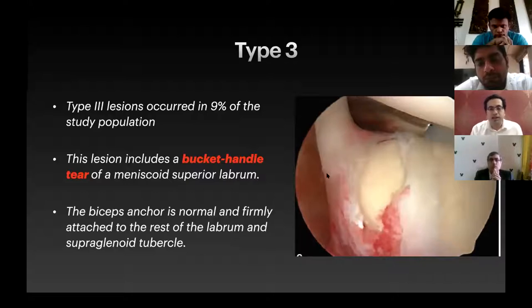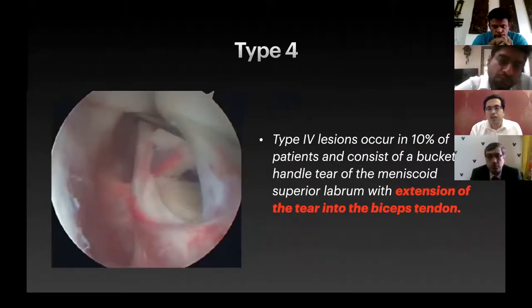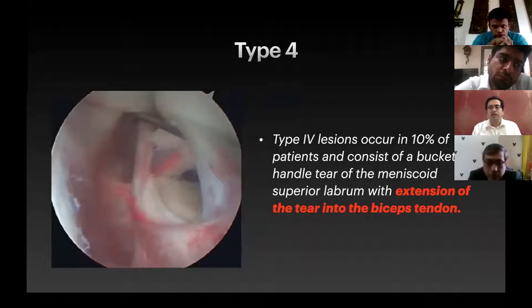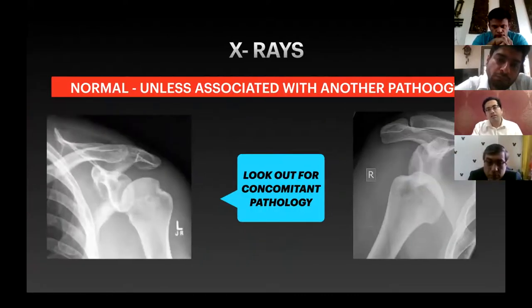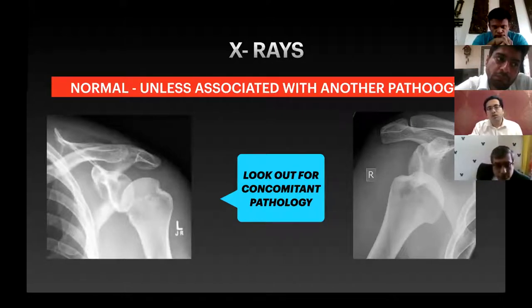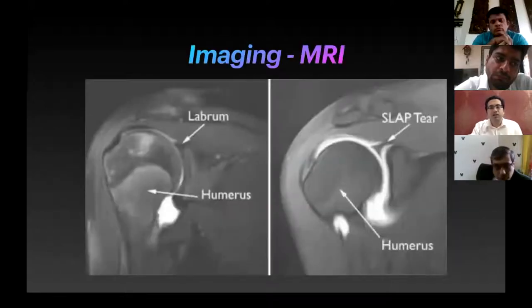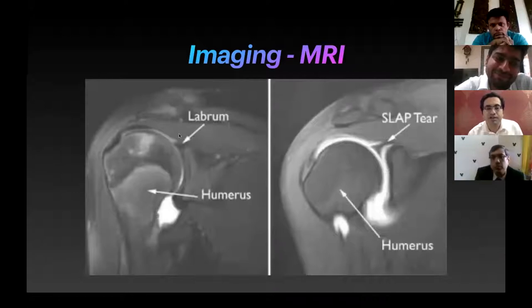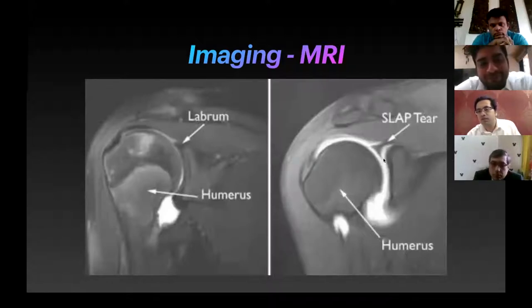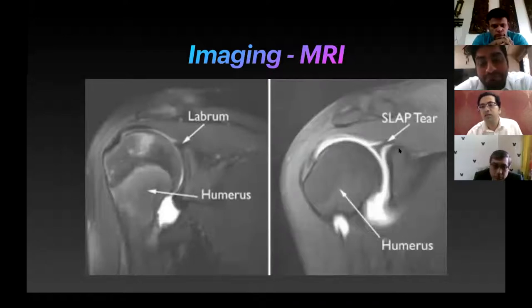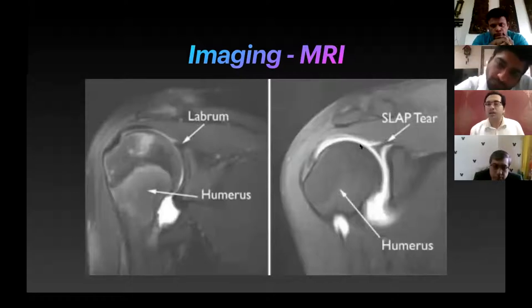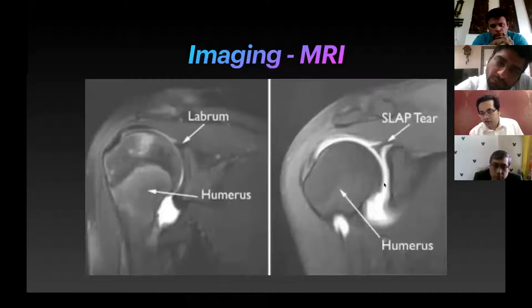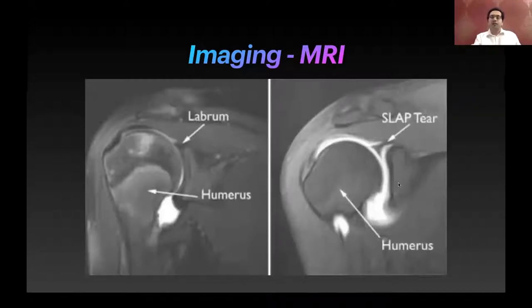X-rays are usually normal unless associated with another pathology. MRI is quite sensitive for SLAP tears. Normal MRI is around 65 to 70% sensitive and specific; with the addition of arthrogram, you can detect up to 95% of SLAP lesions. On the left is a normal labrum with continuity with the superior glenoid, whereas on the right there is fluid passing between the superior labrum and the glenoid rim — that is an MRI arthrogram appearance.